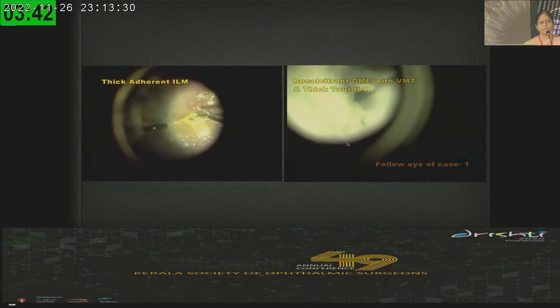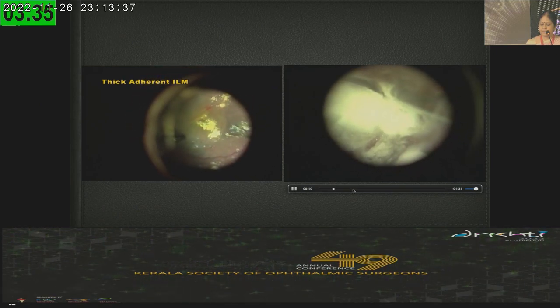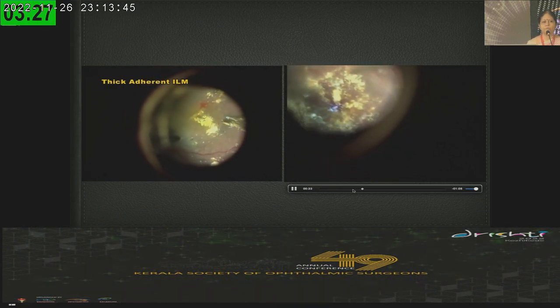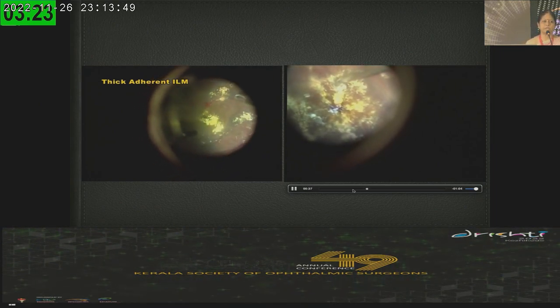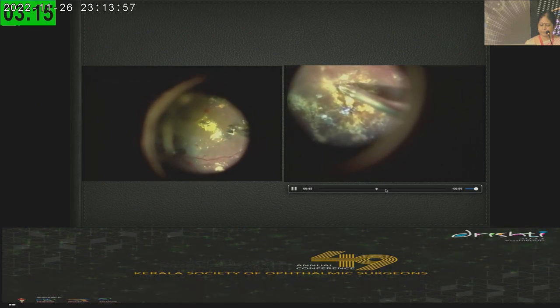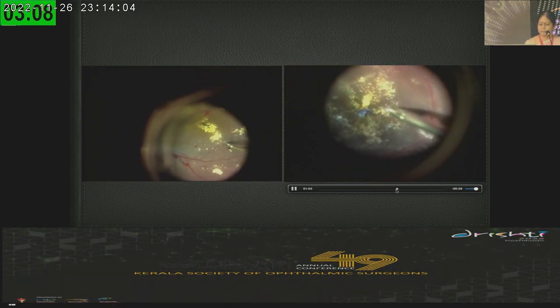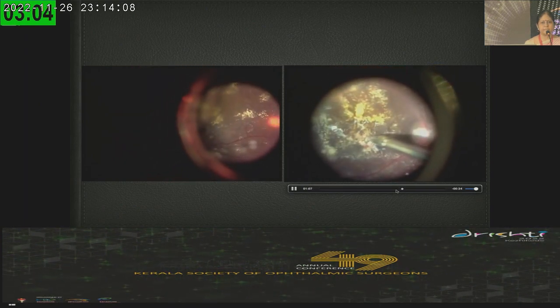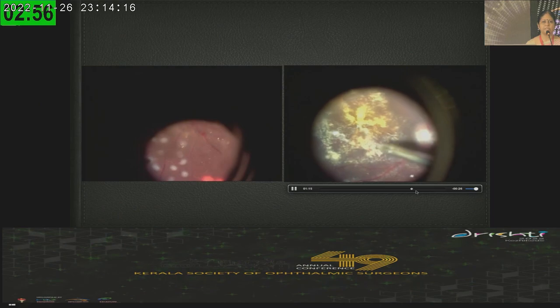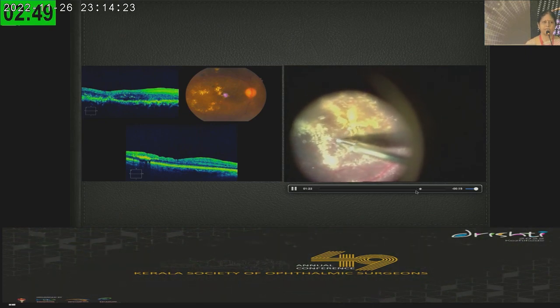This is his other eye — a more extensive pathology. Here PVD is induced and look at this macula — this is not the stage when you should be doing surgery. You should counsel him for surgery at an earlier date. You can hardly make out the contrast between the internal limiting membrane and the swollen retina. The membrane comes out almost as a single layer, mostly because his laser may not have been effective due to retinal swelling. You use a combination of all factors — laser, anti-VEGF — and I leave behind a little triamcinolone at the end of the procedure so that the steroid can cause a reduction in retinal swelling in the postoperative period.